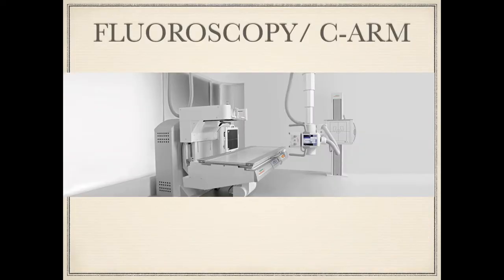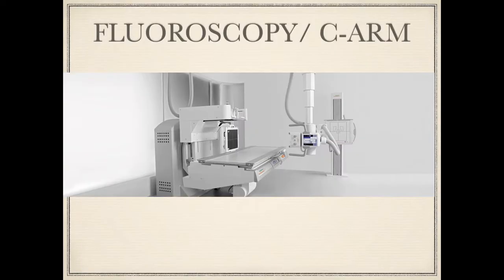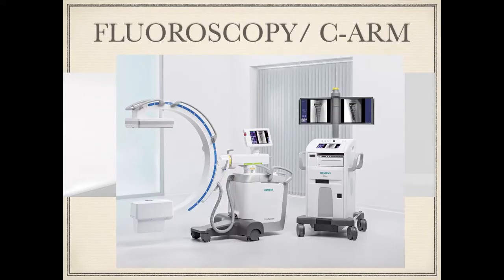As we discussed before, the presentation today is on C-arm controls or image optimization and radiation exposure. What you see on your screen is an image of a fixed fluoroscopy machine, which is commonly used in most hospitals you would go to, and I'm sure you've all seen that before. Now compare this with a C-arm, which gets its name from the C shape.